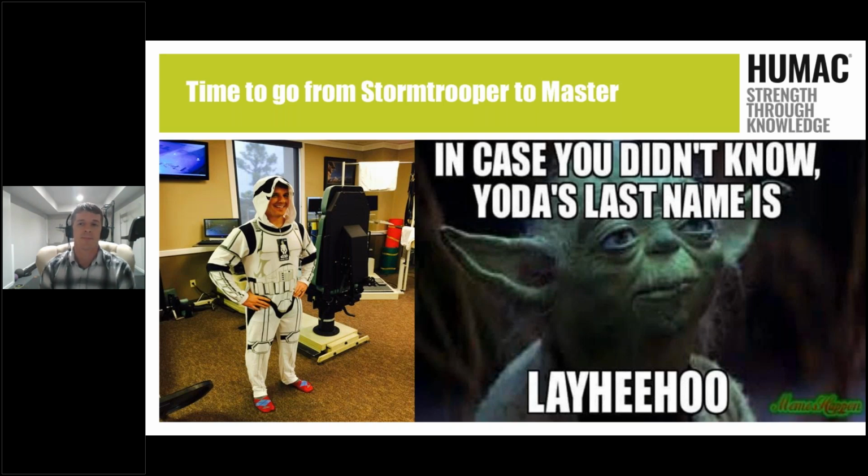It really comes back to research. Isokinetics has a long-term aspect in regards to research, and the way that we apply it in today's world is a little bit more appropriate. When we talk about taking them through the modes of rehabilitation, we can do passive range, isometric, isokinetic for strengthening, isotonic for control aspects, and then we can take them into functional training programs and monitor how well they're generating force in that range of motion effectively, isometrically, concentrically, and eccentrically.